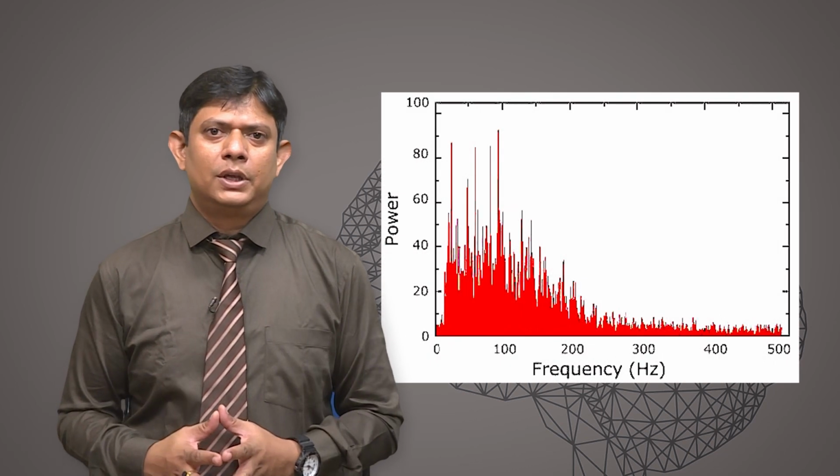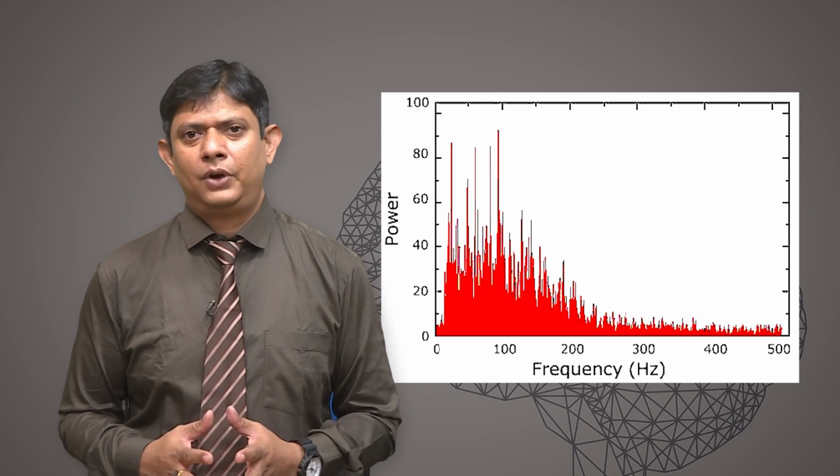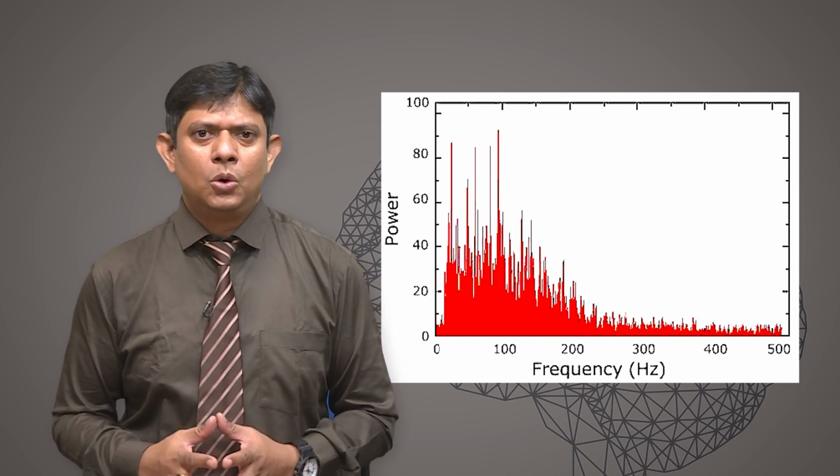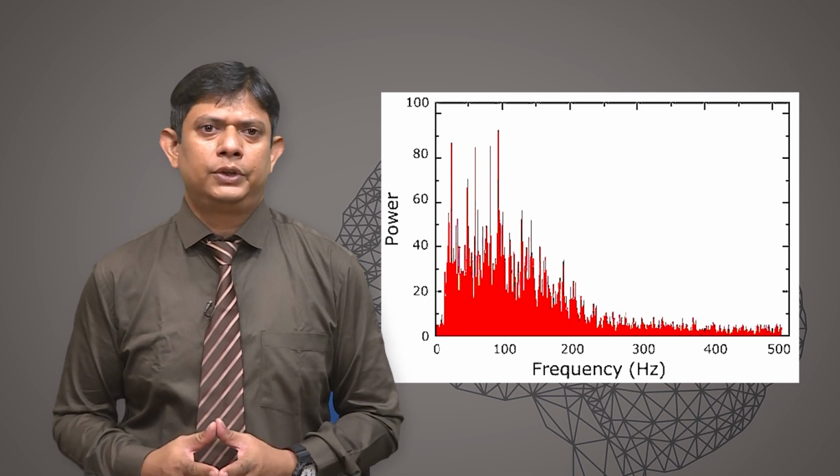Typically, the frequency of an EMG signal ranges between 6 to 500 Hertz, showing the most frequency power between 20 to 250 Hertz. An EMG signal is influenced by the firing rate of motor units, which in most conditions fire in the frequency range of 0 to 20 Hertz if multiple motor unit firing is involved.